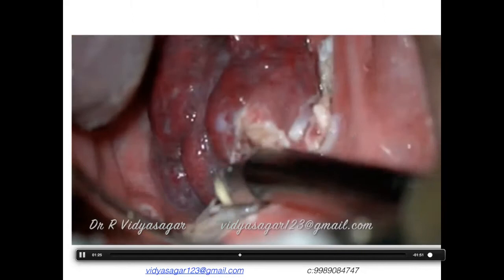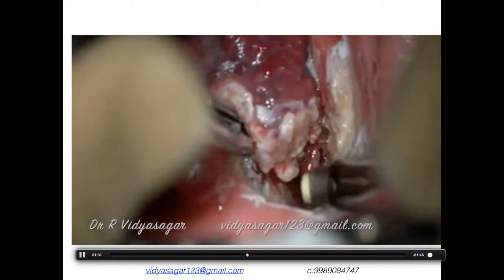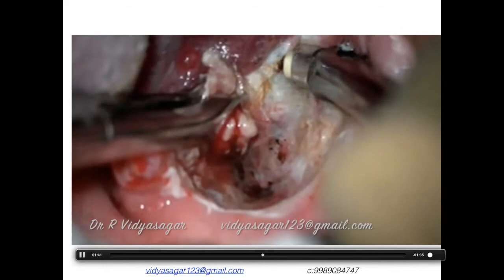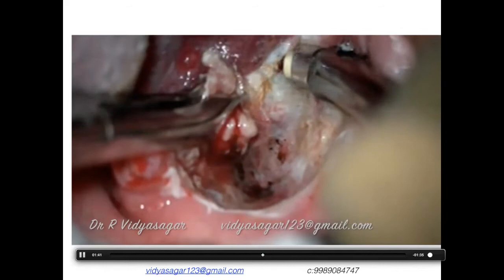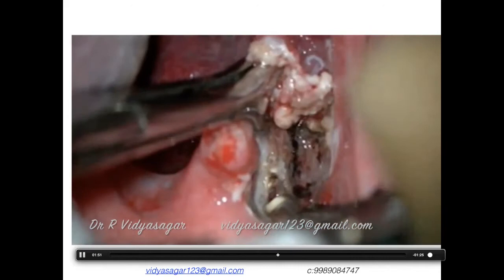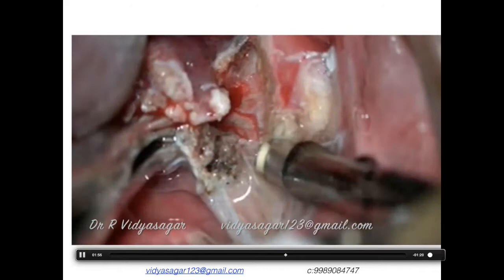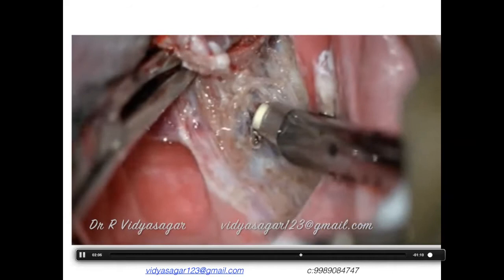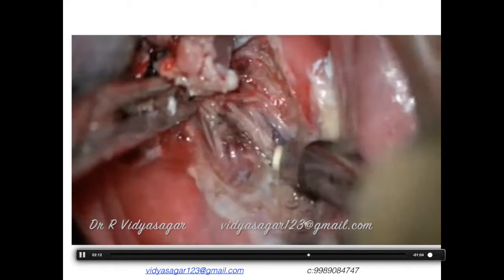This is a beautiful use of coblation — precisely ablating and coagulating the venous sinusoids. When getting into venous sinusoids, use contact mode with coagulation, pressing the pedal in an alternating manner — you cannot continuously press. Press the blue button intermittently in contact mode for coagulation.